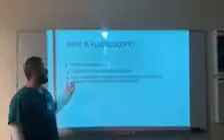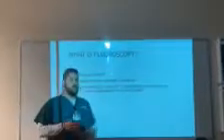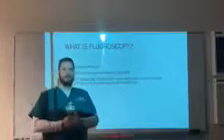What is fluoroscopy? Fluoroscopy is a type of X-ray modality that is used in the radiologic field, in medicine, and it shows continuous X-ray images on a monitor. On that monitor, you see the anatomy or instruments used dynamically to see if the patient has any perforations or any type of illnesses or diseases.